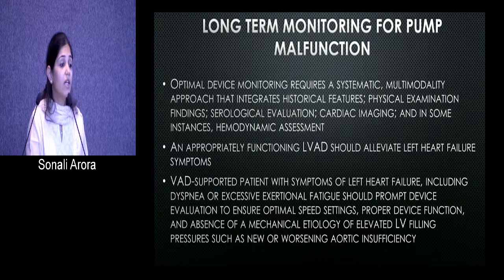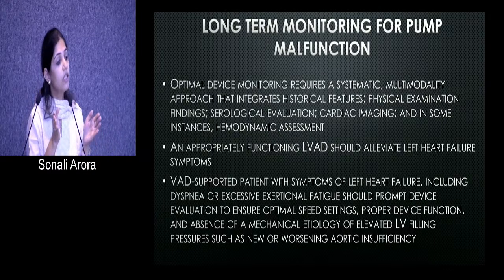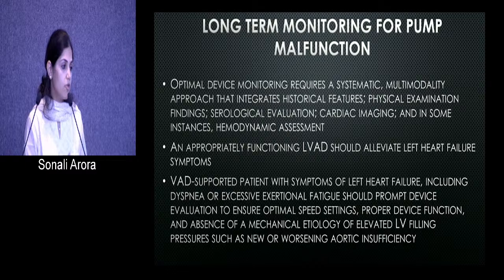These patients will get a ramp study to see if they are unloading well, or if you're suspicious of a thrombus. A ramp study being that you increase the speed of the LVAD and you see the size of the LVIDD on the echo. If the size decreases when you're increasing the speed, that means the LVAD is unloading appropriately. If your size remains static or does not decrease, then you have to start thinking, is this a pump thrombus we are talking about? Of course, this will not be in isolation. You'll be doing an LDH, a haptoglobin, a plasma-free hemoglobin, all these features which will suggest whether there is a thrombus or hemolysis.